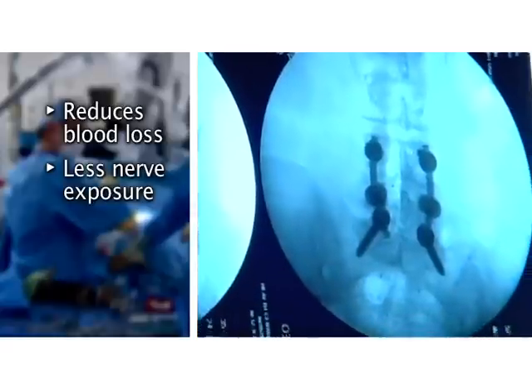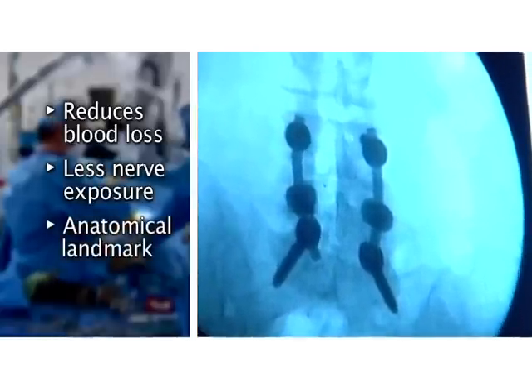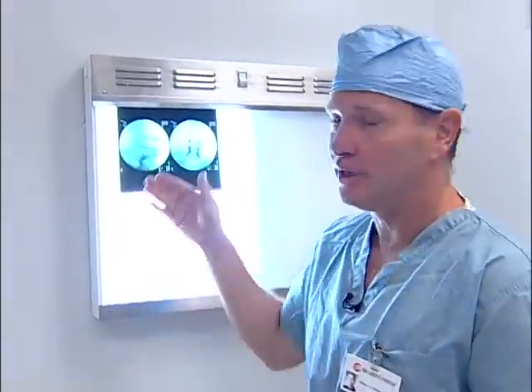Part three is really the neuronavigational component of the screw itself. In using a headless screw, once you've placed them fluoroscopically, with absolute certainty you know the regional anatomy around each pedicle screw. Once we have the screws in, I think we have the best neuronavigational tool currently in existence. It's in situ. We know exactly where, with a 360-degree radius, every element is: the central canal medially, the foramen or the nerve root inferiorly, the disc space superiorly, the extraforaminal space laterally. Like the dial on a clock, you can do your preoperative planning using that radius around each headless pedicle screw.